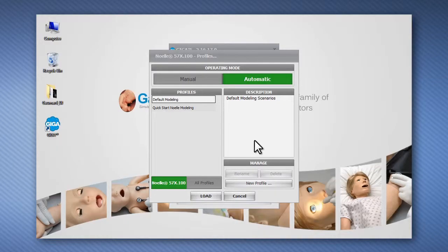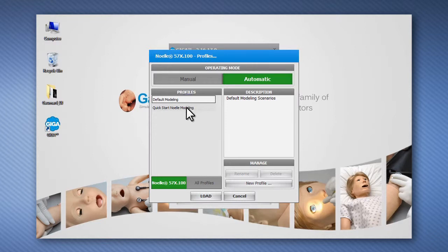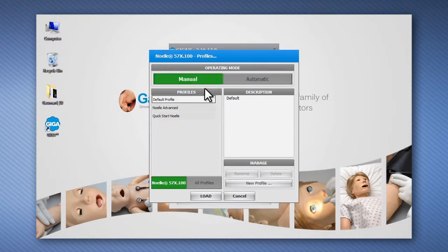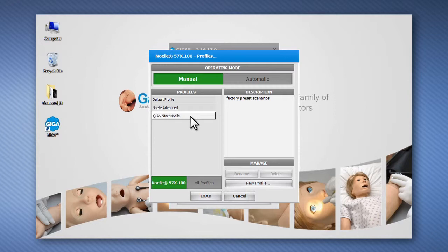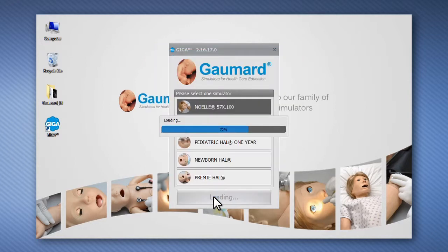Each operating mode includes several user profiles. The Quick Start and NOEL Advanced profiles include more than 35 pre-programmed scenarios to get started with simulation. To begin, select the operating mode and a profile and then click Load to continue.